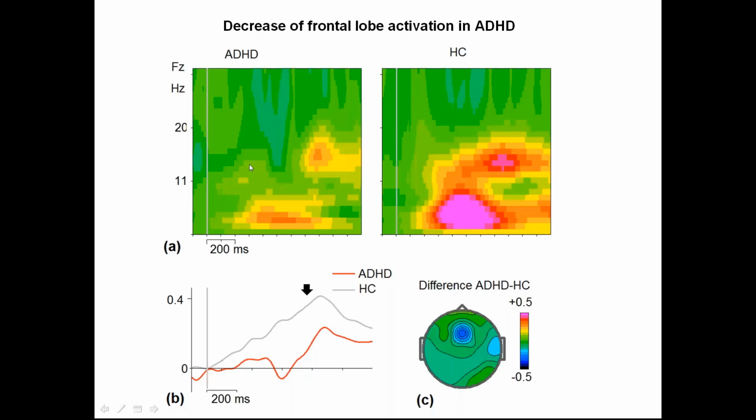And I think that you can see here that the children with attention deficit disorder show a low level of frontal activation in the low beta frequency band.